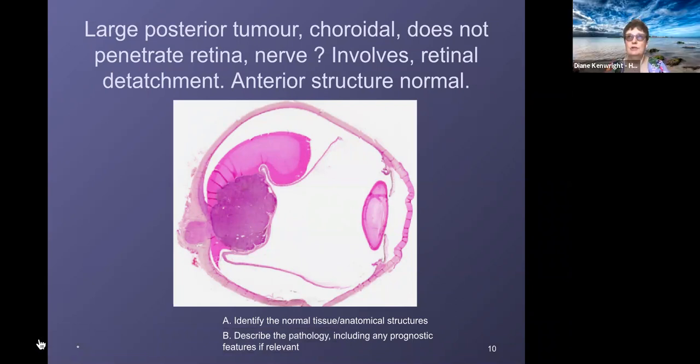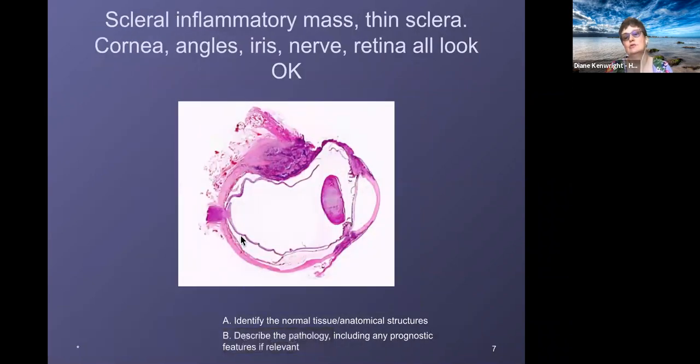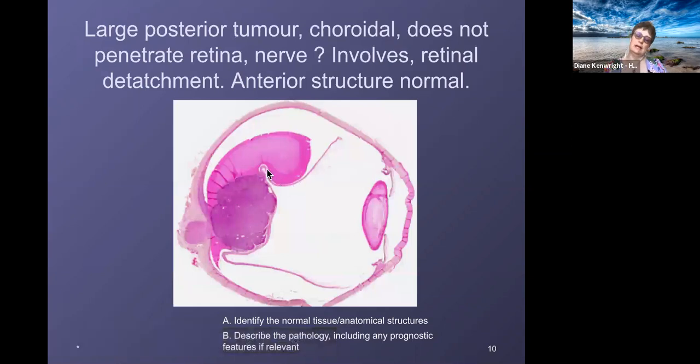So let's talk first about real retinal detachments and retinal detachments due to artifacts. There was one back here. I thought this was an artifactual retinal detachment. If we look here, we would see intact photoreceptors. They would just look as if they'd been torn off, but they would be basically intact. Whereas a true retinal detachment has loss of photoreceptors. So the first thing is: is it artifact or is it real? And the photoreceptors will tell you that.